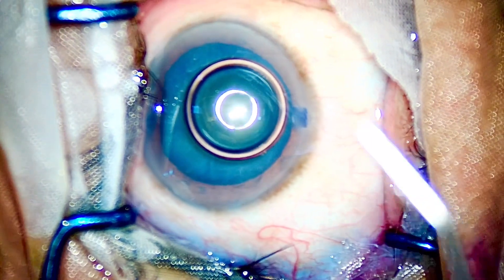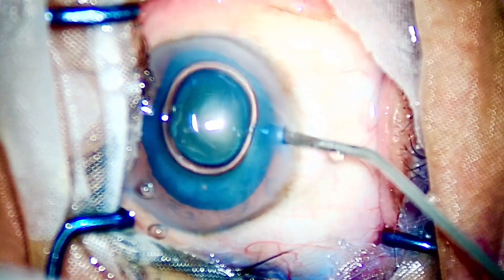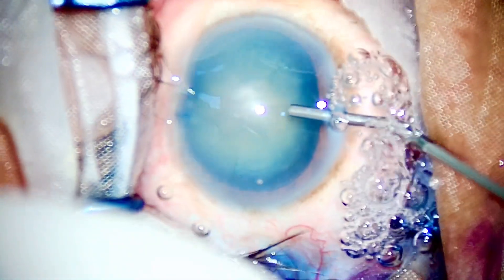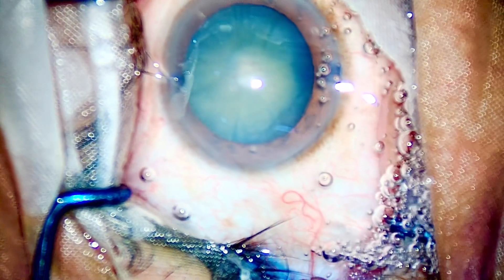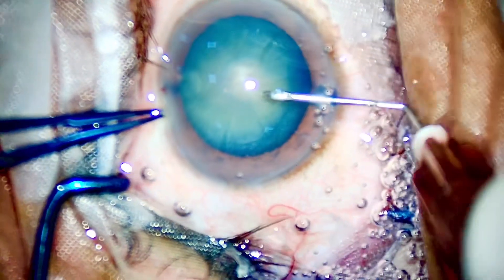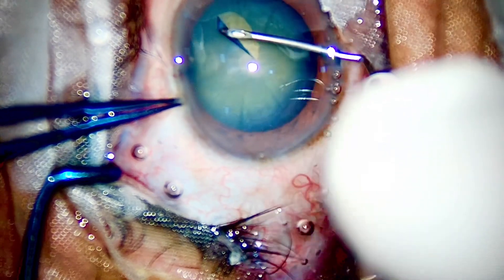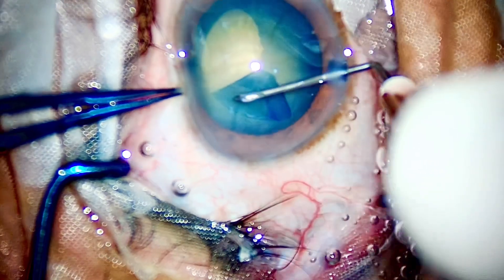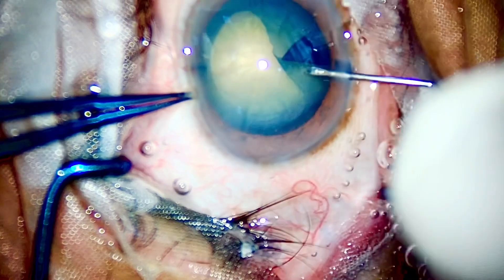I'll be using the Oertly, which has a flared tip. I must say all these modern phaco machines from Alcon have a small tip compared to the Oertly and AMO Compact, so it is better to grab hold of the nucleus with a broad tip. Once you have started the rhexis, I'll make sure it does not run out and does not run in — I need a good, decently sized rhexis for achieving good phaco cracks.